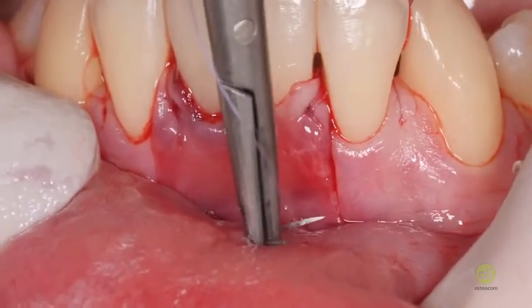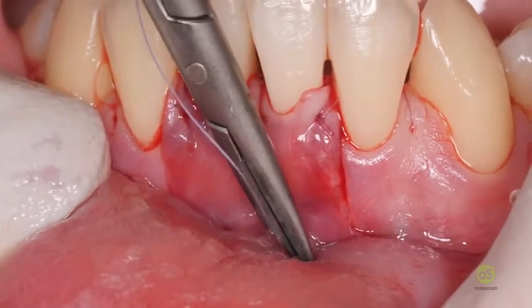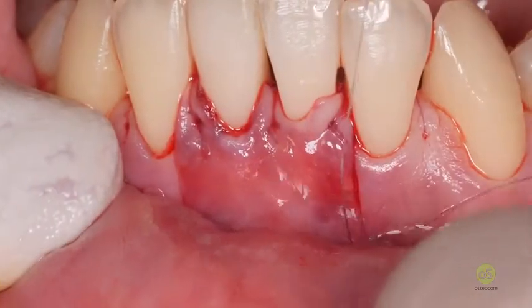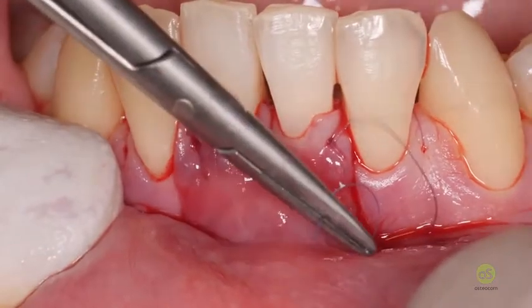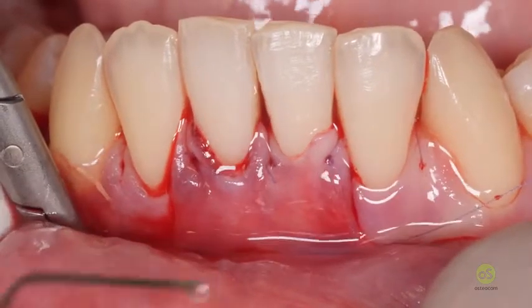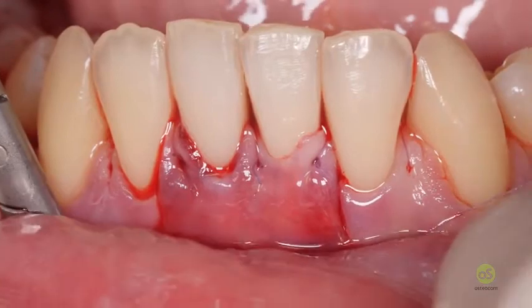Most apical extension, vertical release incision, take the periosteum, alveolar mucosa adjacent. This is a periosteal anchorage suture in the area where the muscles were removed. And now when I close this suture, you see that the verticality of the vestibulum depth is completely restored. You see the flap is vertical, it's attached to the periosteum.